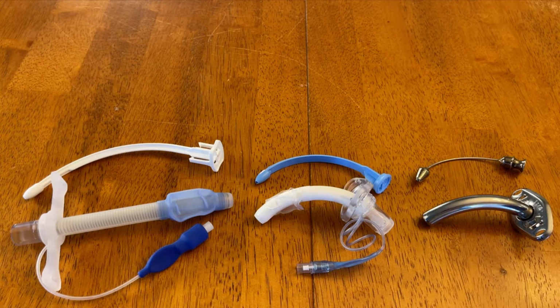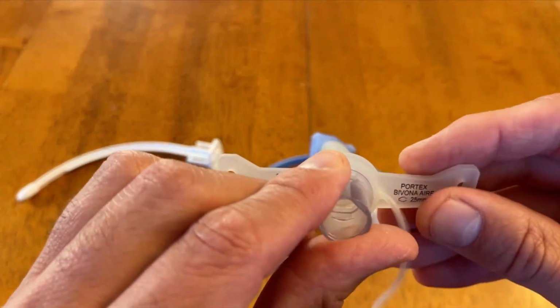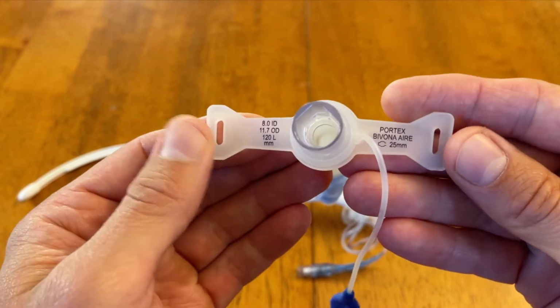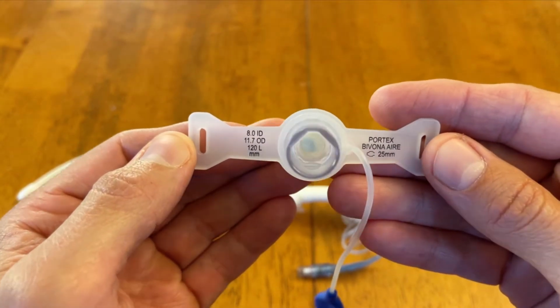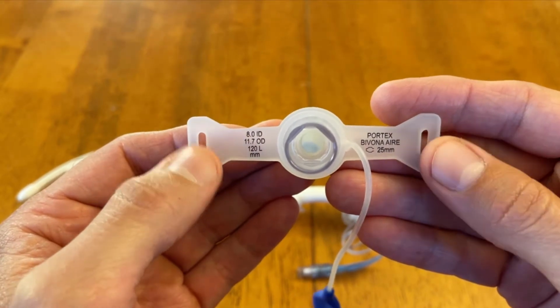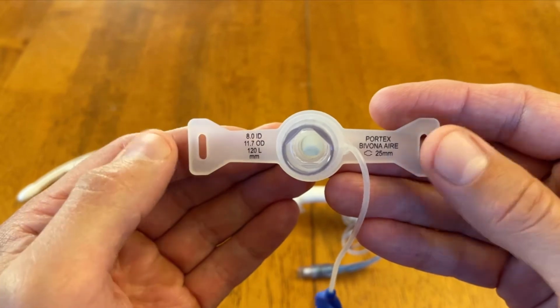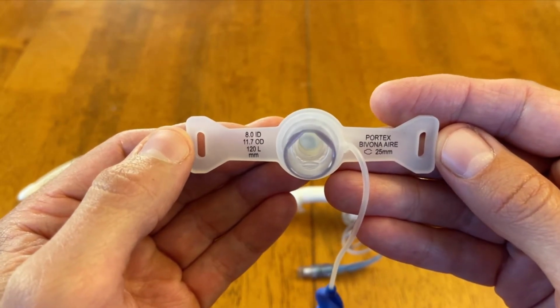So let's start by looking at this first one over here. This is my Bivona, and I'm going to hold it up here to the camera because I want to show you what I'm holding in my hand here is what's called the flange, or the neck plate, that fits against the patient's neck, obviously, and you can see there's a couple holes, one on each side here by my thumbs. That's for our trach ties to go through to secure it into place.